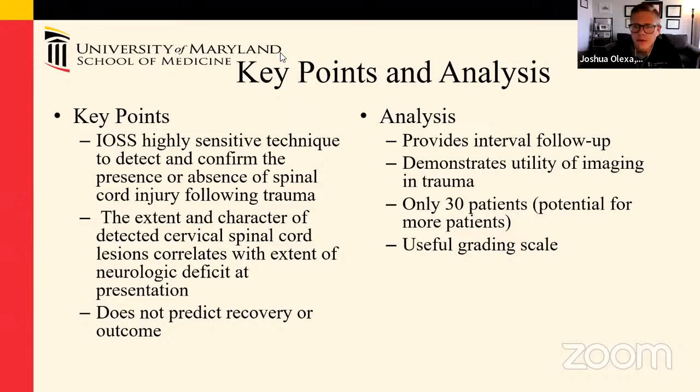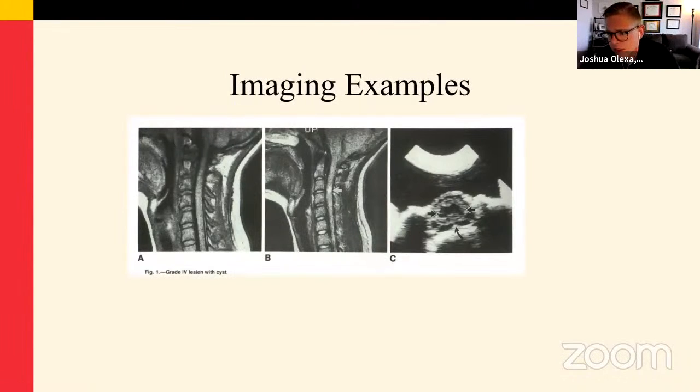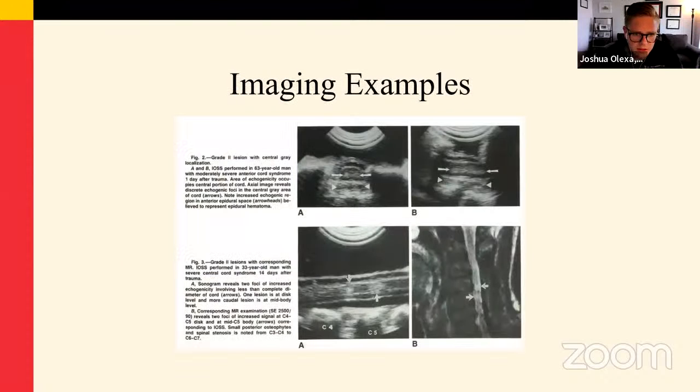Yeah, actually, if you go back a couple slides, that first picture may be a hematoma, the full extent and diameter of the cord, and then the next one too, I guess. The next slide, where you see those areas where it's lighting up, that arrow at the bottom would be concerning, I think.